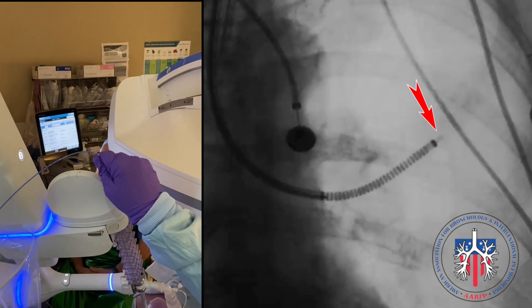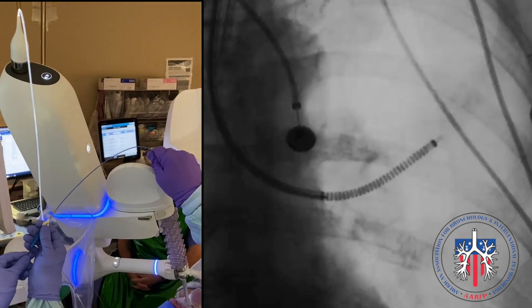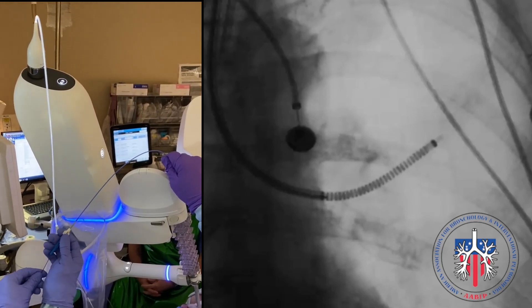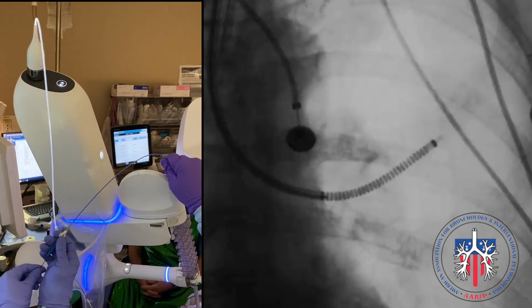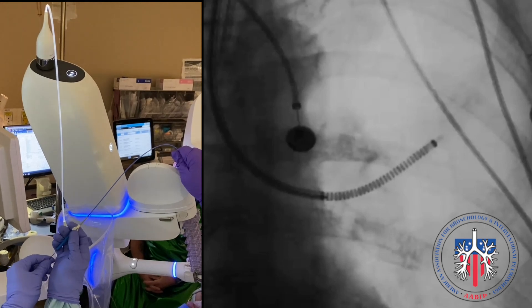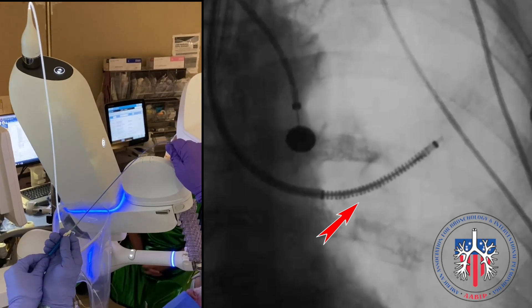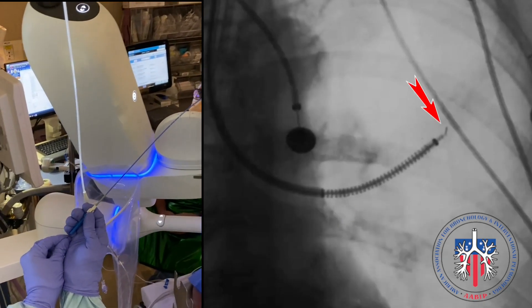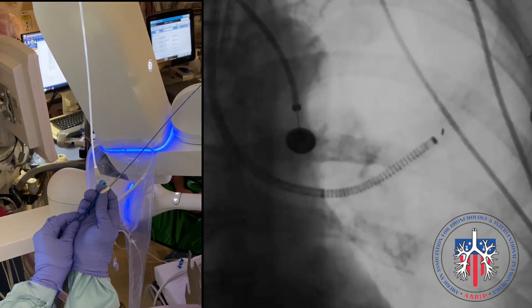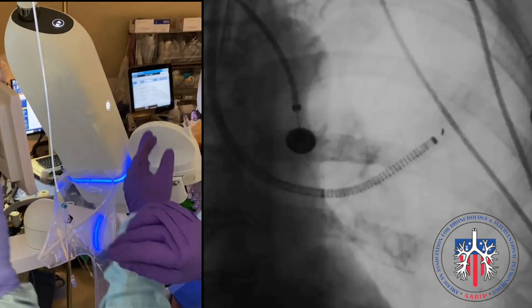The white markers indicate when the catheter is closer to the tip of the bronchoscope. When the catheter is out of the tip of the bronchoscope, at that moment the guide wire is advanced, and by advancing the guide wire, a continuous push of the fiducial continues until it is deployed within the lung nodule. The catheter is then pulled back to confirm the fiducial is within the lung tissue.